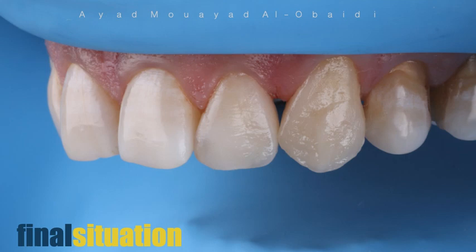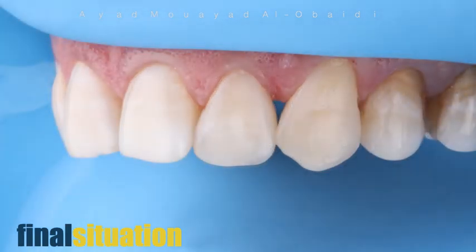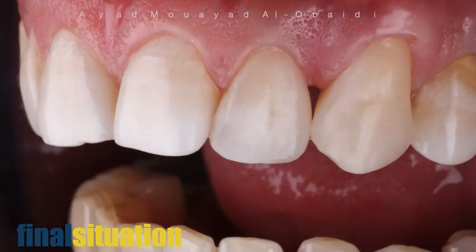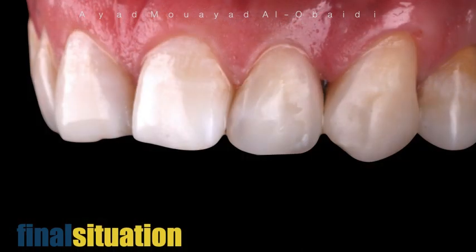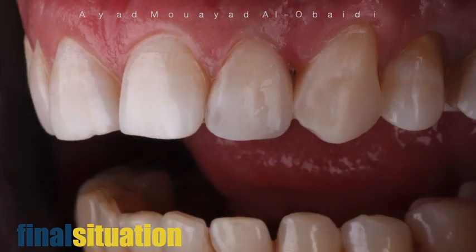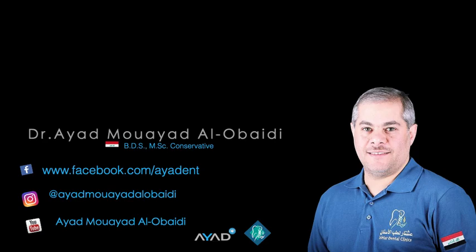After that, we finish the restoration by making the layering process. This is the final result. This technique helps as a guide in the planning and management of palatal shells shape and emergence profile. Thank you.